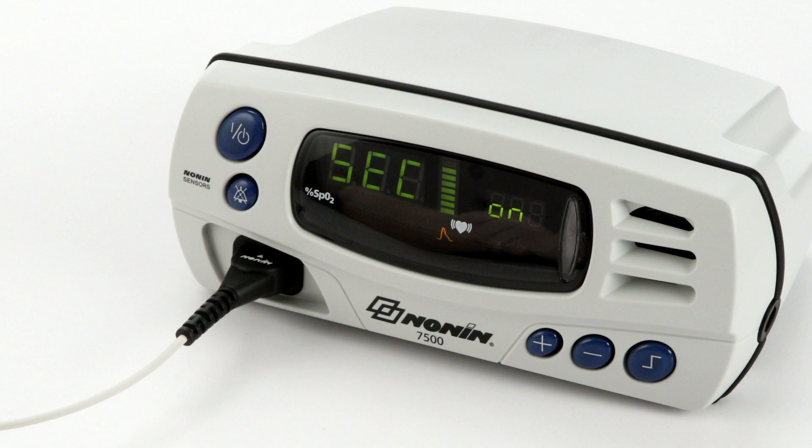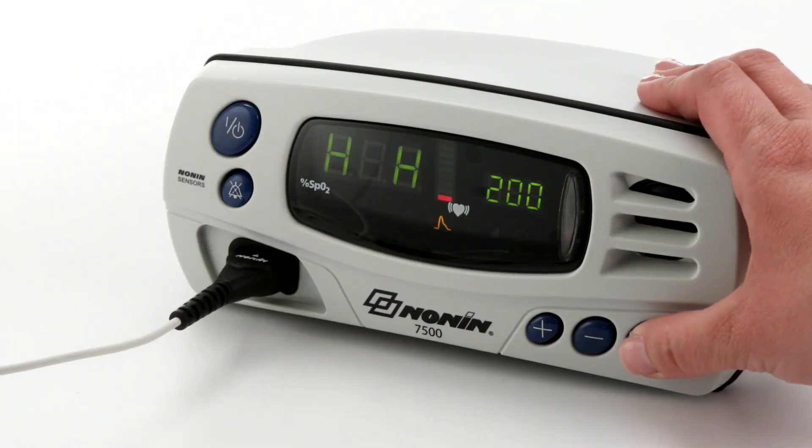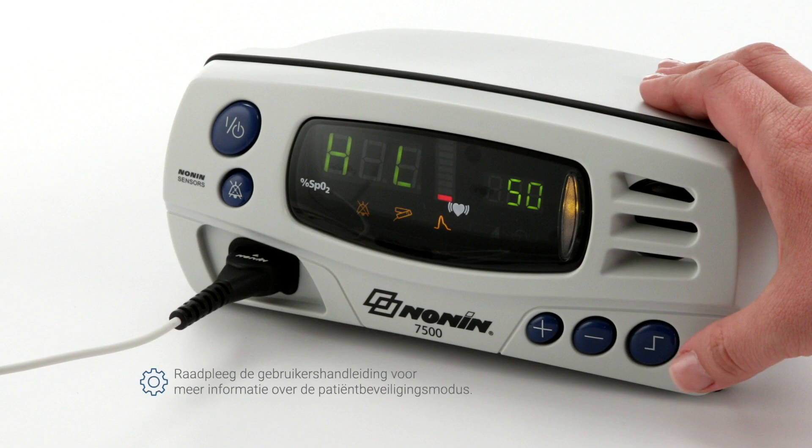When the Model 7500 is turned on in patient security mode, SEC ON is displayed in the display area and three informational tones sound. The upper alarm limits are then displayed, followed by the lower alarm limits. Refer to the operator's manual to learn how to set or cancel patient security mode or reprogram settings.